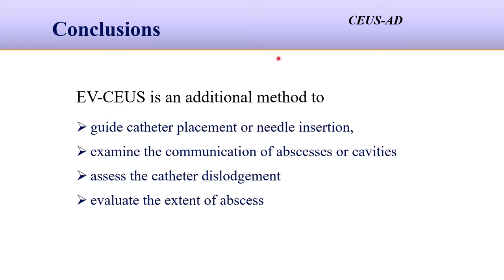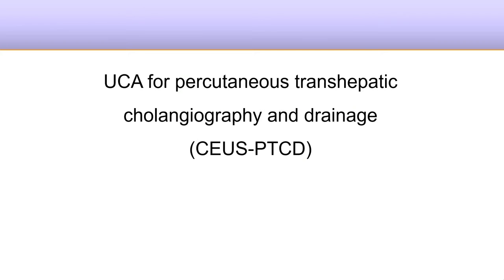Conclusions for abscess drainage: extravascular contrast enhanced ultrasound is an additional method to guide catheter placement or needle insertion, to examine the communication of abscess cavities, to assess the catheter dislodgement, and to evaluate the extent of the abscess. The second application is percutaneous transhepatic cholangiography and drainage.